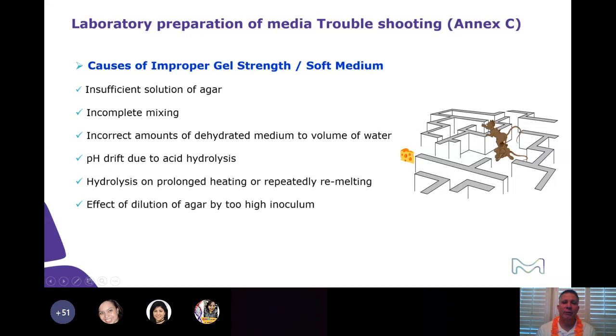You want to make sure, again, that you have that agar completely mixed, because the agar is what's going to solidify that medium. So mixing is the biggest deal. Mixing, people will do it on the hot plate. You got to watch your hot plate, because certainly if you leave it almost indefinitely, it'll flow over the top, and that's just a big giant mess if you've ever done that in a media kitchen. So some other chemistry, some other stuff based off of too much heating, not enough mixing.